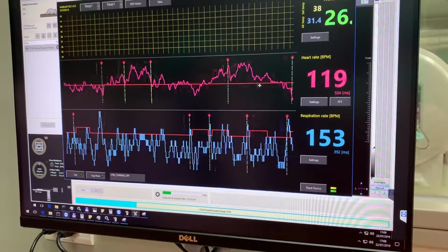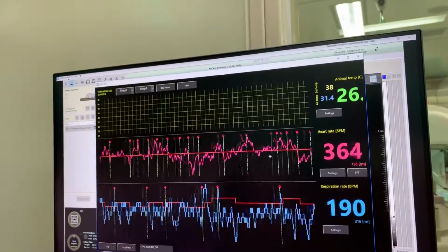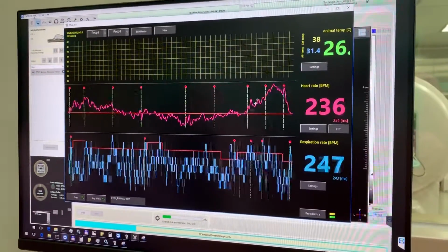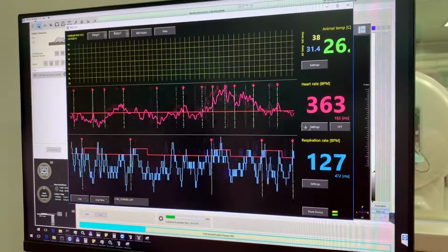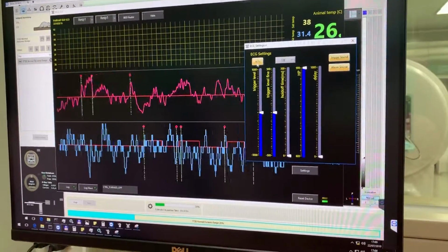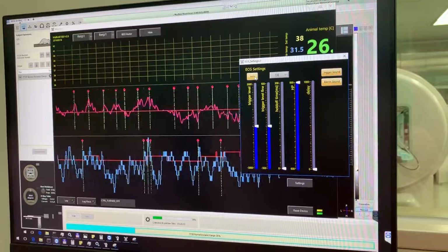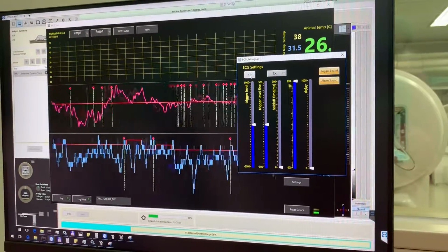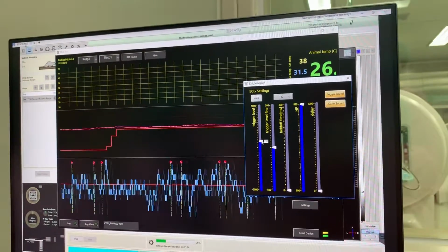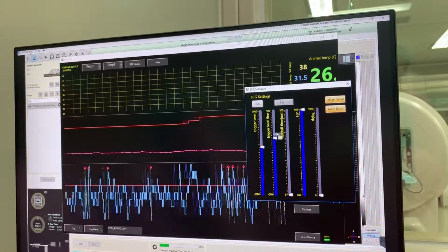Because if you see it on a real-time curve, the threshold is automatically adjusted to the curve itself. So if somehow it is moving up, the threshold is also increasing. But because it is an automatic thresholding selected under the ECG settings, for example, if we turn it off, we can manually adjust the threshold. So if you look at the monitor, it is either roughly or slightly modified.